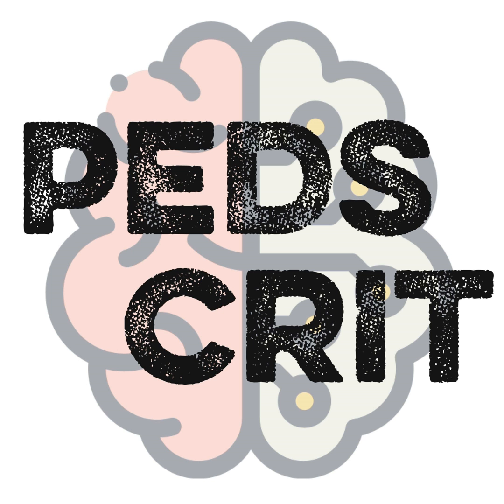Nice. We've also mentioned this a little bit, but when you're making your plan on rounds for your APRV patient and you're starting to talk about airway clearance, how do you manage airway clearance on APRV? Are you doing the same sort of nebs, open suction? And then you expect it to be better or you expect it to be worse? So you can definitely maintain the same airway clearance regimen on APRV that you would in conventional SIMV ventilation.